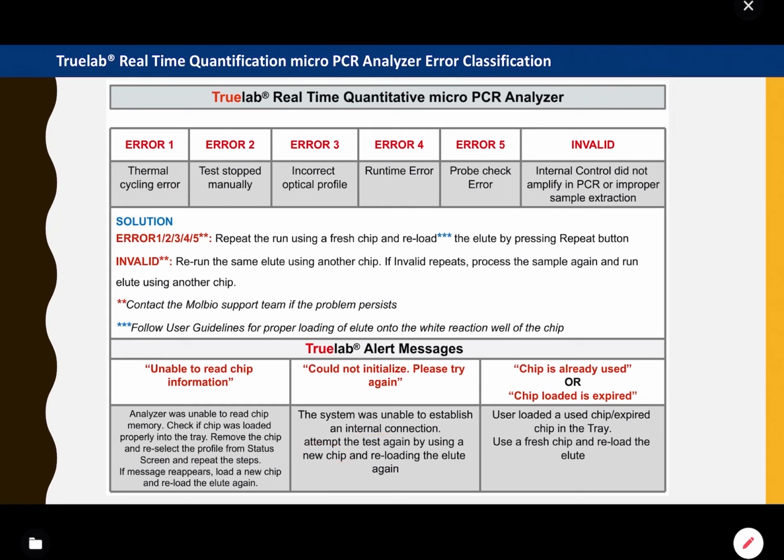And if by mistake you have left the previous chip inside, and without loading the new chip you press start test, then it will also give an option saying the chip which is loaded is already used.